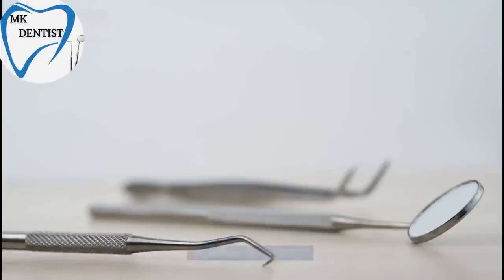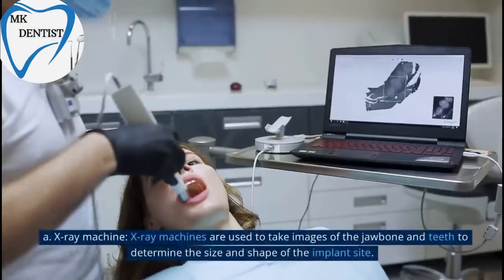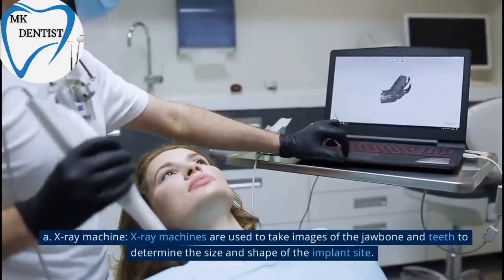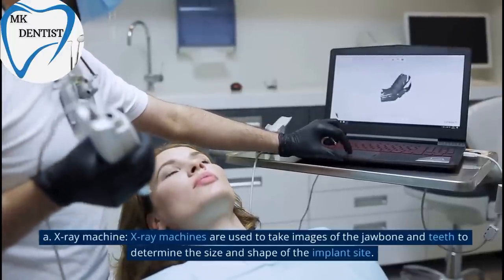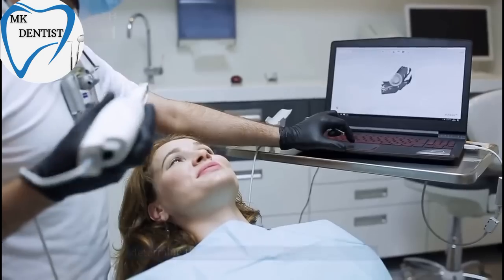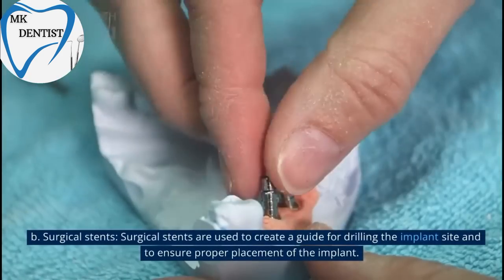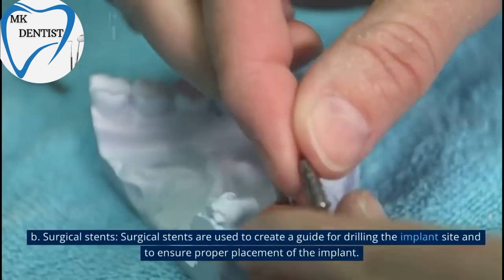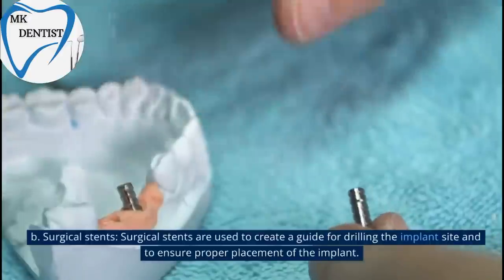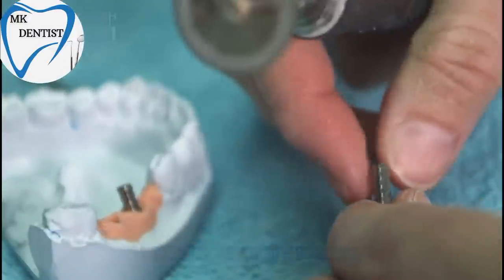Diagnostic Instruments. A. X-ray Machine. X-ray machines are used to take images of the jawbone and teeth to determine the size and shape of the implant site. B. Surgical Stents. Surgical stents are used to create a guide for drilling the implant site and to ensure proper placement of the implant.